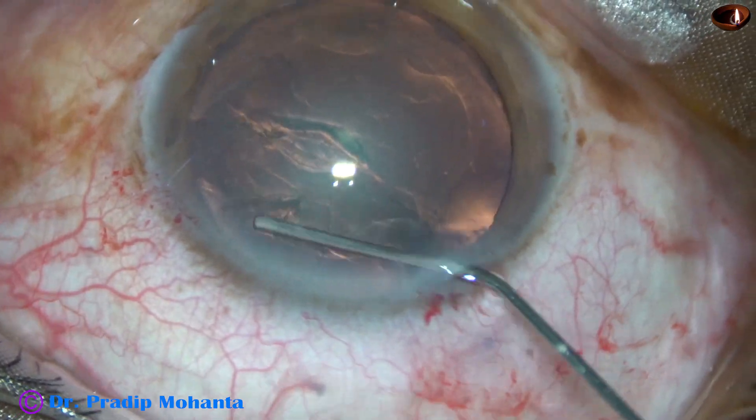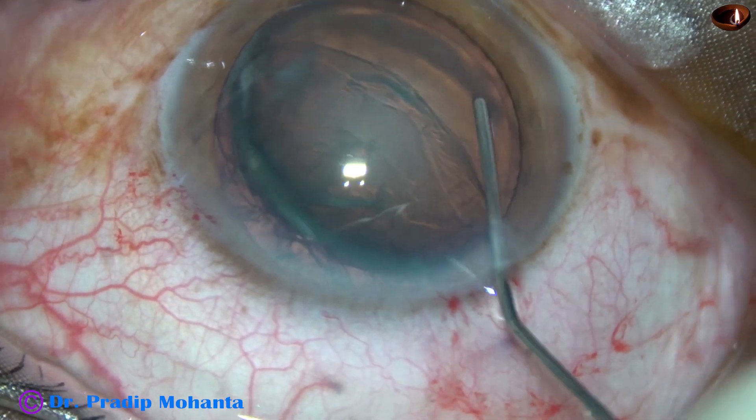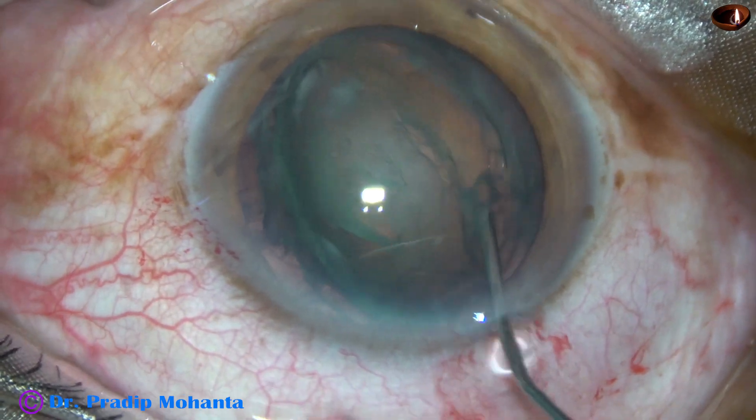And now, see what happens during hydrodissection. As I do hydro, the lens tilts like this.